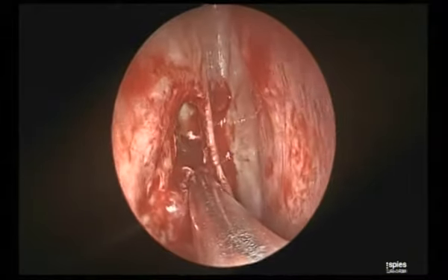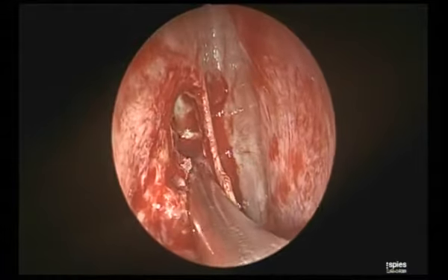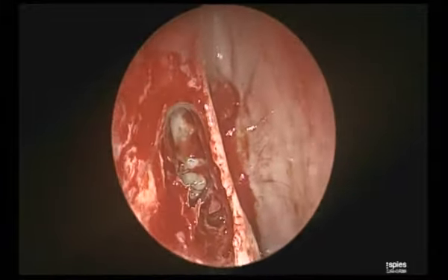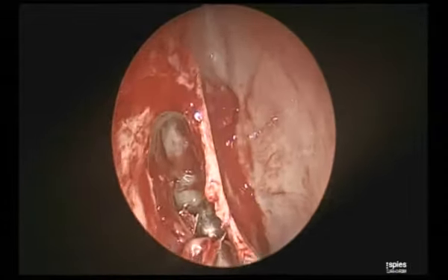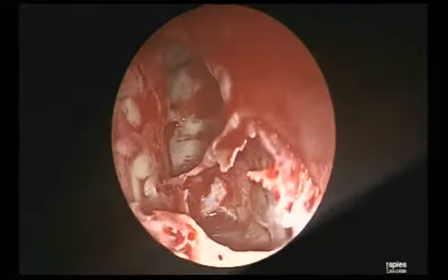See this? I am removing just the anterior most portion of the upper part of the bulla. Can you see that? Yes. Now what is coming in the way? I can see my artery behind the suction block. See my artery behind, just behind this. Can you see that? See the artery behind.